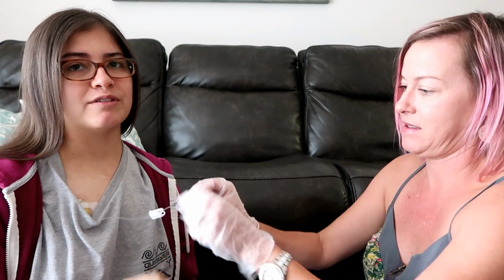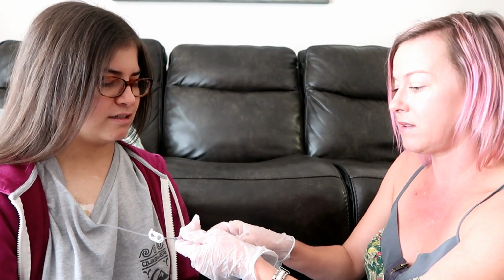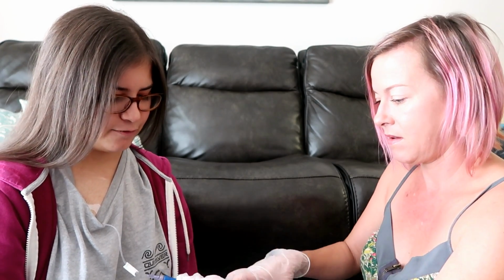I had perfect blood return yesterday, last night even, so. Yeah, and if you have a port, I would highly recommend getting your blood drawn via port if you can. It's just, you don't have to get stuck. Yeah. No. And I don't feel it at all.